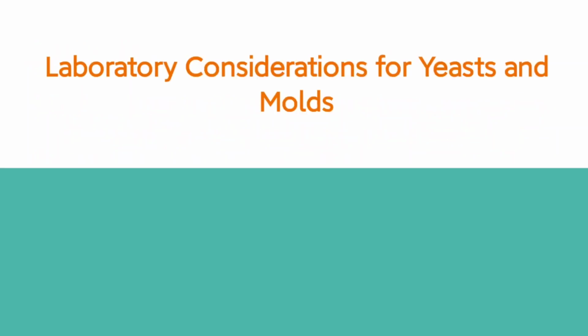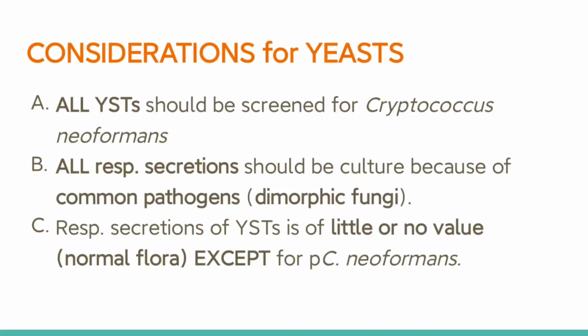Next is laboratory considerations for yeasts and molds. First, dito muna tayo sa yeasts. Considerations for yeasts. Number 1, letter A, all yeasts should be screened for Cryptococcus neoformans. So, basically, if you have received a specimen and according to your physician, to rule out yeast infection, kailangan lahat ng marireceive mong ganon, you need to screen it for Cryptococcus neoformans.